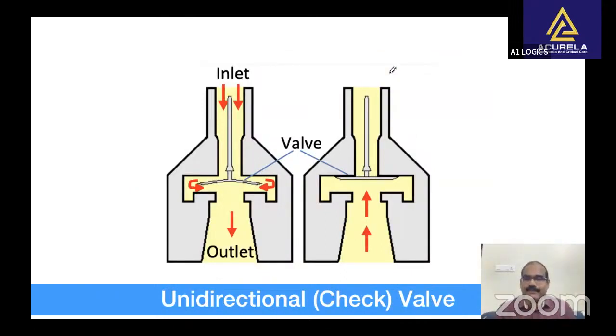The unidirectional or check valve is located between the vaporizers and the common gas outlet, upstream of where oxygen flush flow joins the fresh gas flow. The purpose of the outlet check valve is to prevent reverse gas flow, a situation that would permit fresh gas to re-enter the vaporizer. Thus, it prevents the pumping effect.